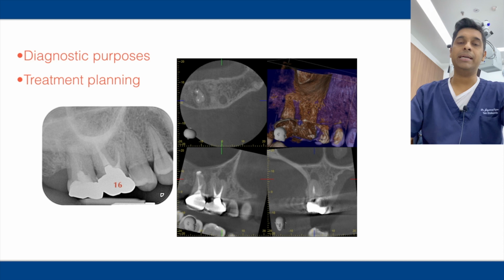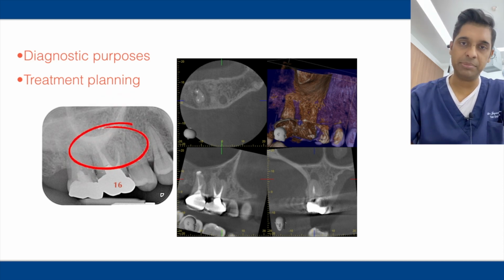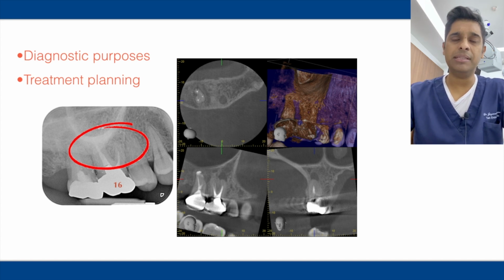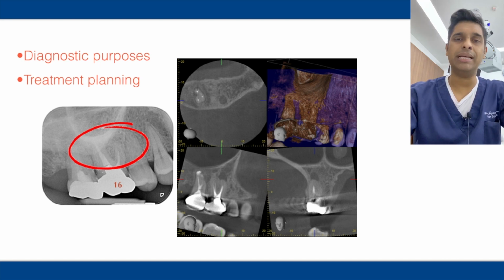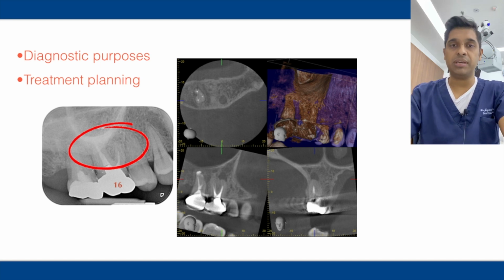If you look at this, I like to use them for both my diagnostic purpose and my treatment purpose. Look at this X-ray, it clearly shows that the right maxillary first molar was the tooth of complaint, and my radiograph shows that in the previously done endo, the buccal root was well short of the apex.